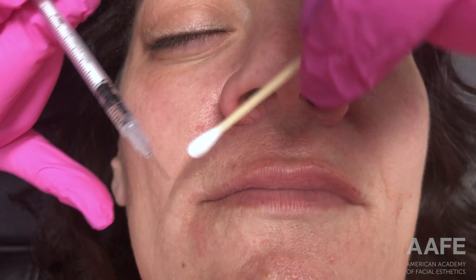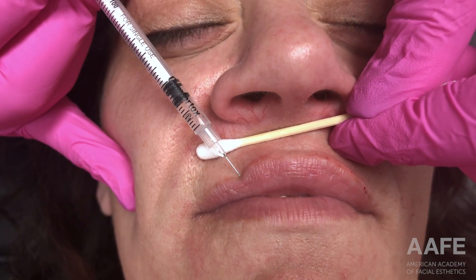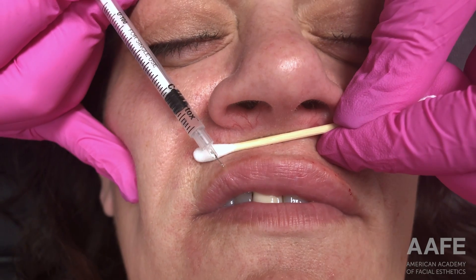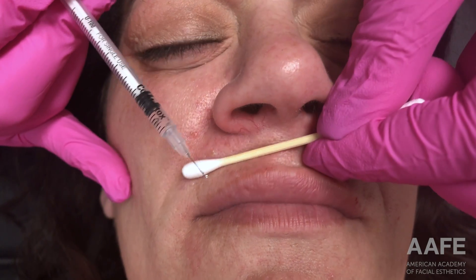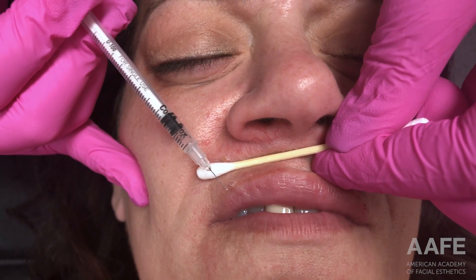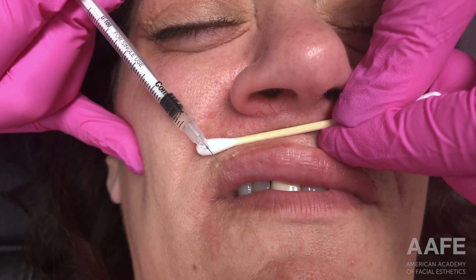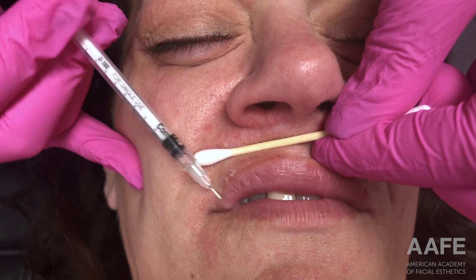It's really nice to have a patient who has never had their lips done before — you can kind of make them your own and create some really nice beautiful lips. I'm starting right within the pink of the vermilion border, never actually entering outside of the vermilion border, just so I'm not creating any opening for the filler to migrate out.